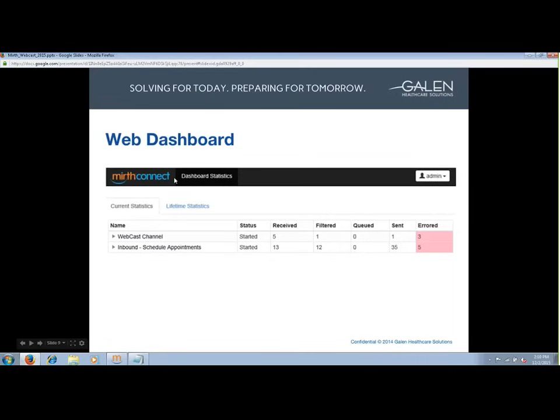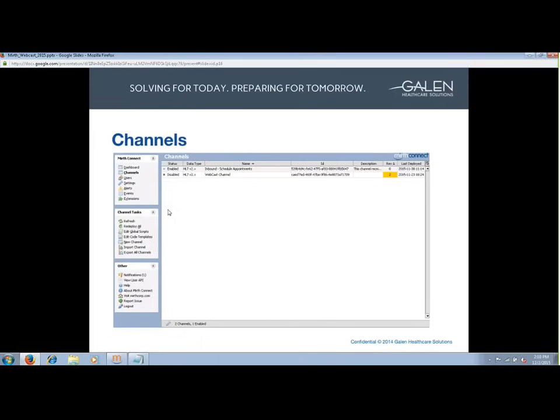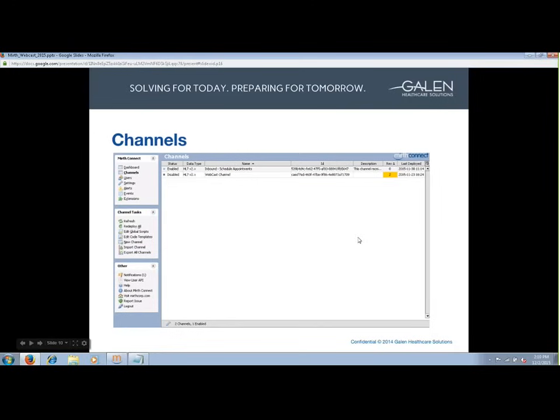In addition to the dashboard within MIRTH, there is also a standalone web dashboard, which allows you to take a quick glance at current and lifetime statistics of deployed channels without actually logging into the engine itself. Channels have four configuration tabs: summary, source, destination, and scripts. I'm going to explain what each tab's function is and then take you into MIRTH to see a basic setup of each.